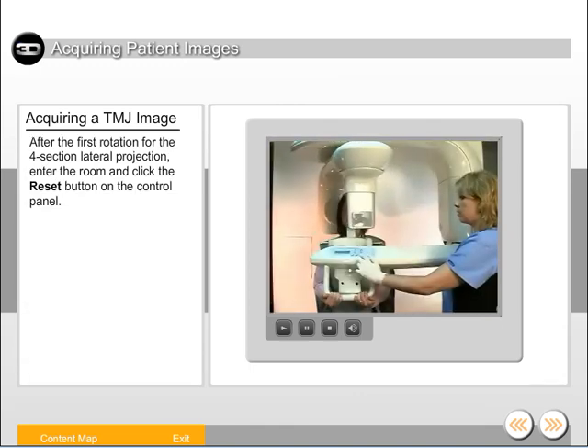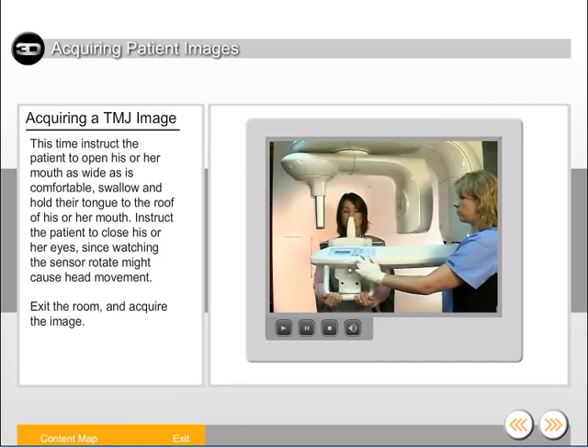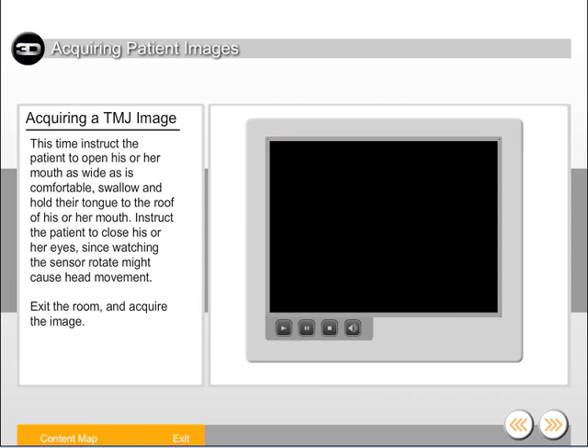After the first rotation for the four-section lateral projection, enter the room and click the reset button on the control panel. This time, instruct the patient to open his or her mouth as wide as is comfortable, swallow, and hold their tongue to the roof of his or her mouth. Instruct the patient to close his or her eyes, since watching the sensor rotate might cause head movement. Exit the room and acquire the image.